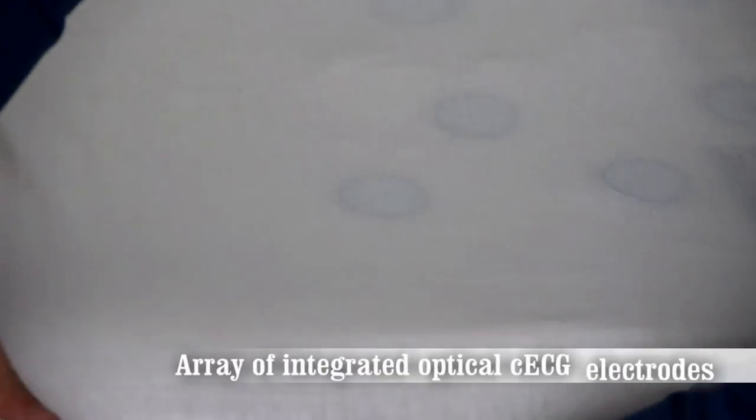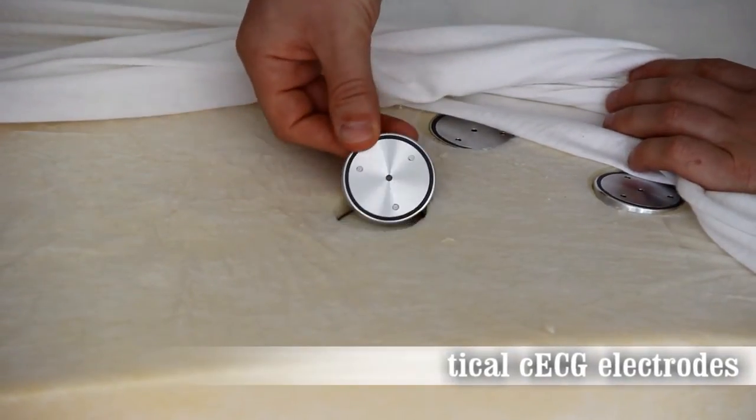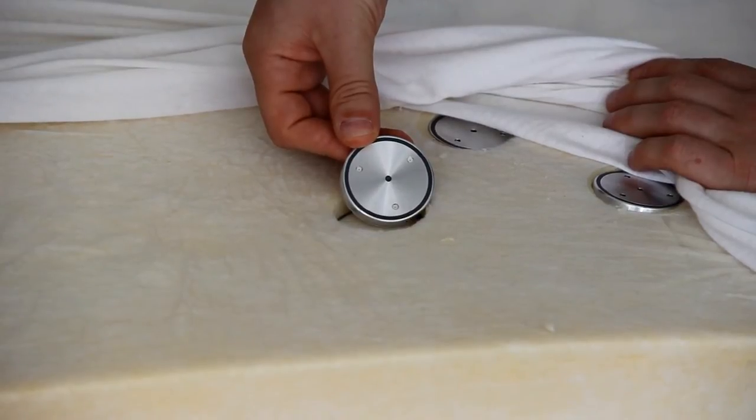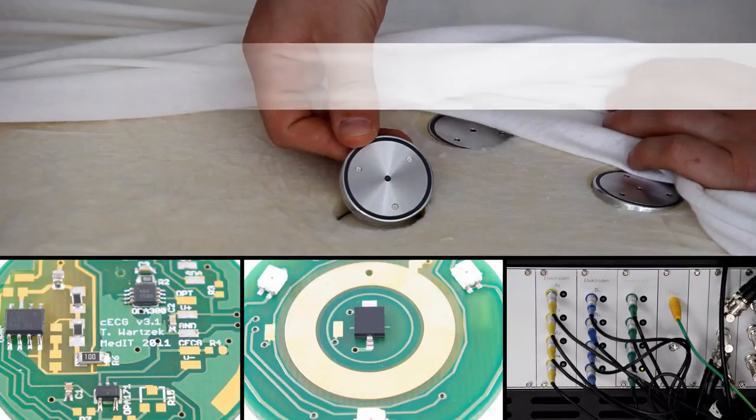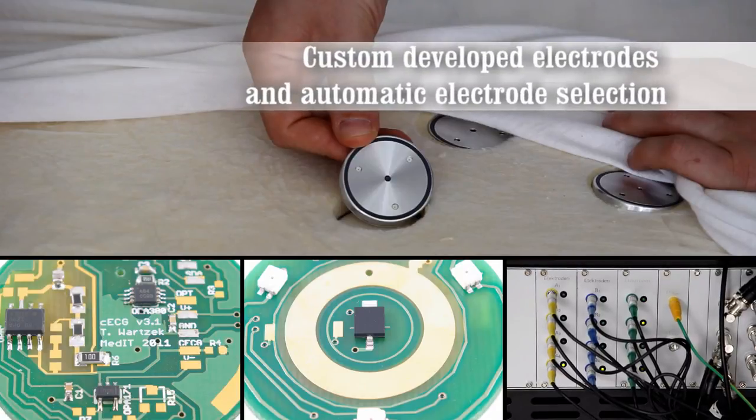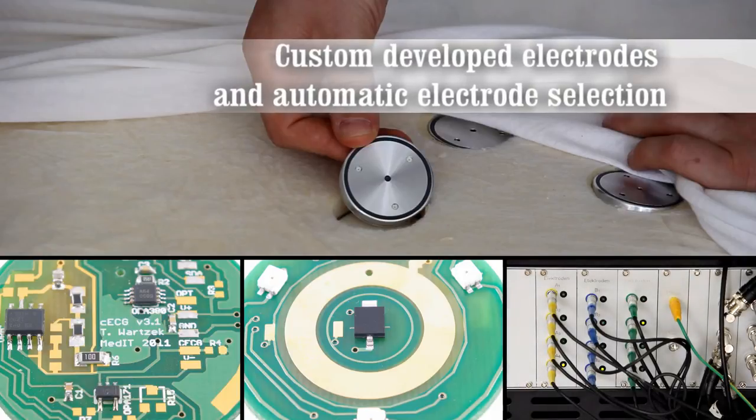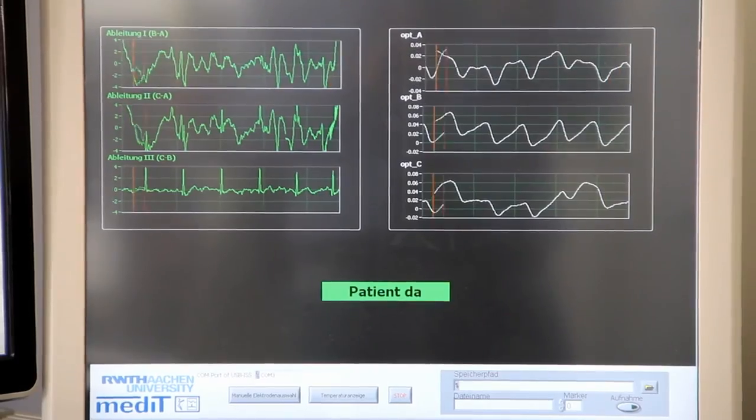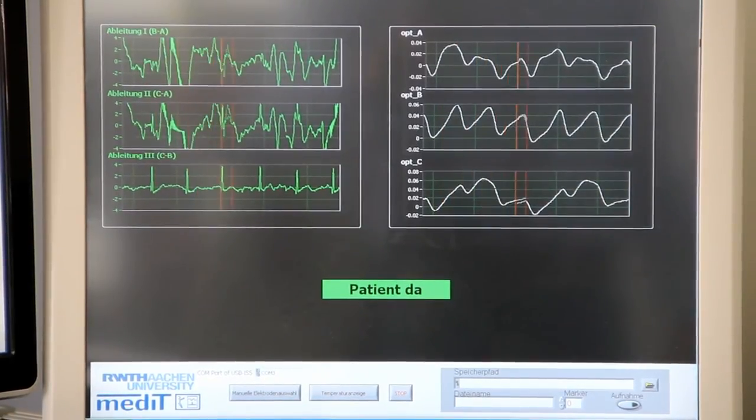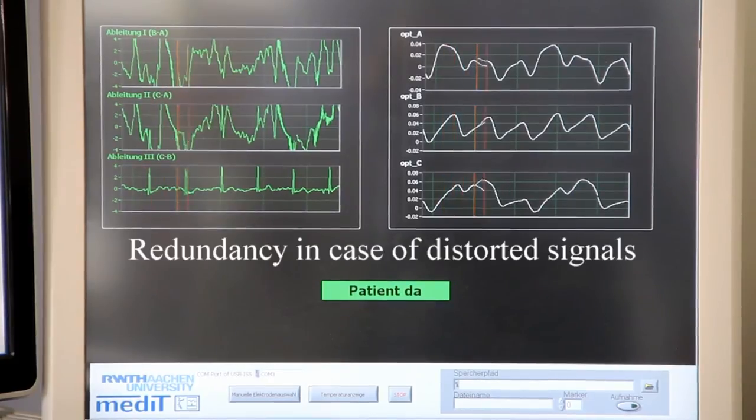In addition to the BCG sensor, an array of integrated capacitive ECG and optical electrodes are used. These custom designed sensors allow ECGs to be measured in a variety of positions through an automatic electrode selection method, which finds the best pairs of electrodes to use at any given time. Besides an ECG, these sensors also record blood pulse signals via infrared sensors integrated into the electrodes.